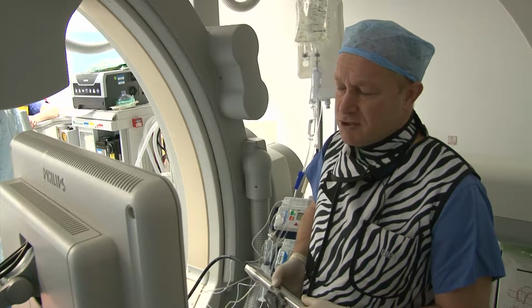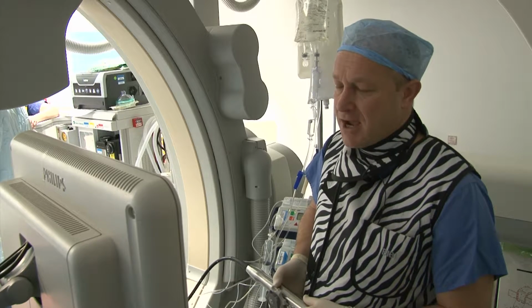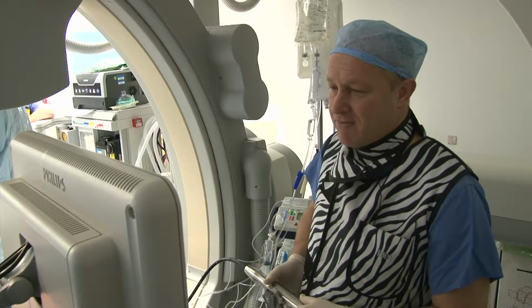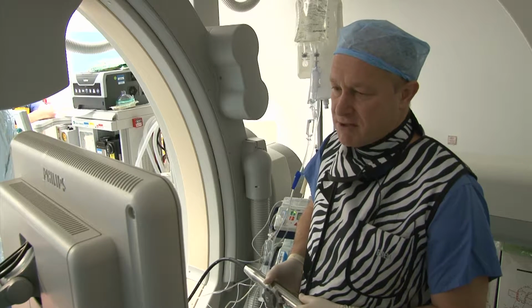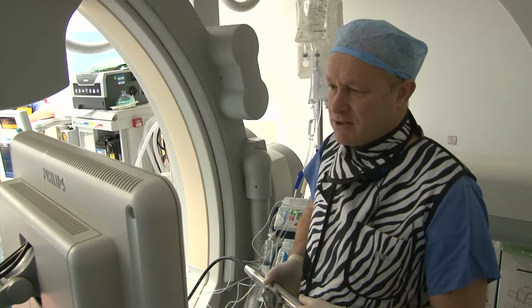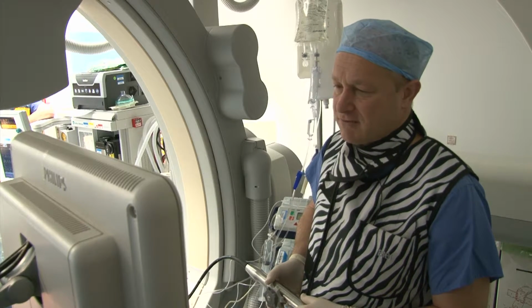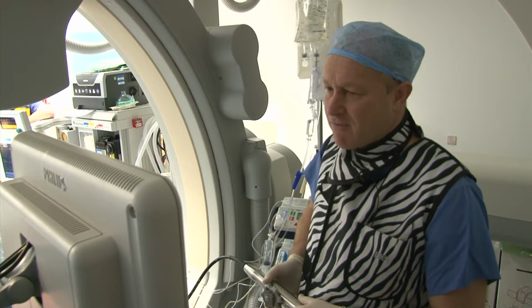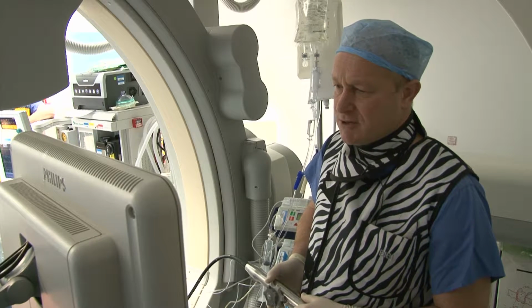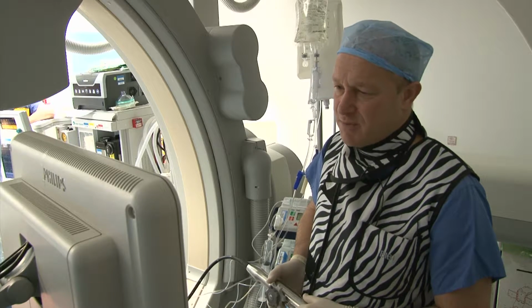So the person who's monitoring the procedure on TOE, it's really important that they get an idea in their own minds of what the left ventricle looks like, whether there is a pericardial effusion, the size and the appearance of the aortic root, the degree of mitral regurgitation, and the calcification and arrangement of the aortic valve, so that if there are complications during the procedure, you immediately know whether there's a change before in your own mind.